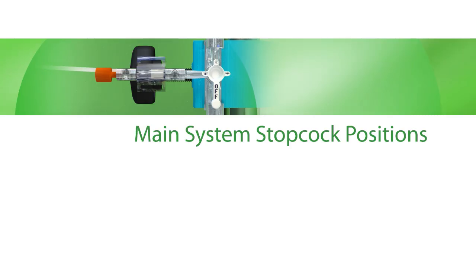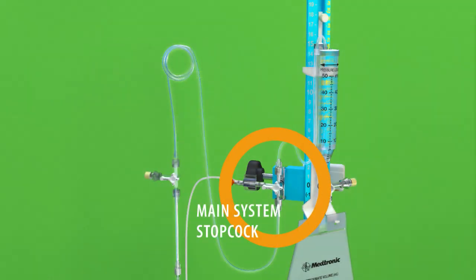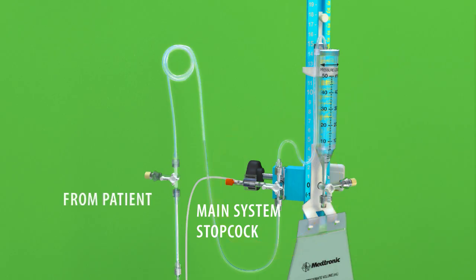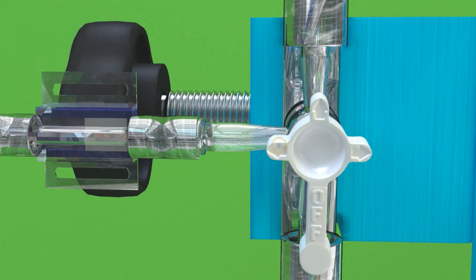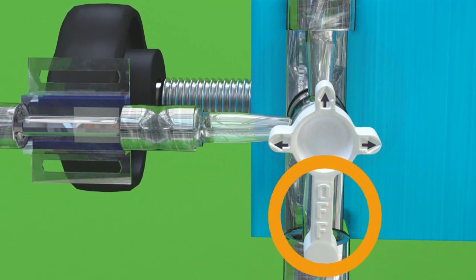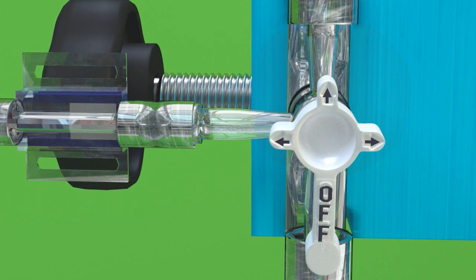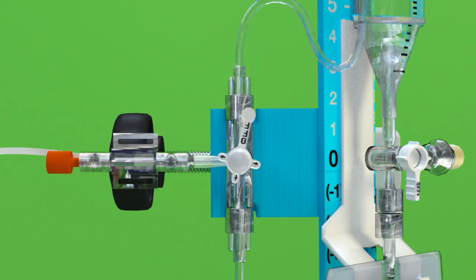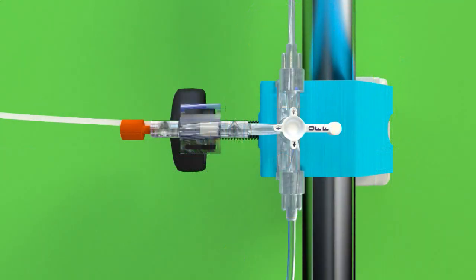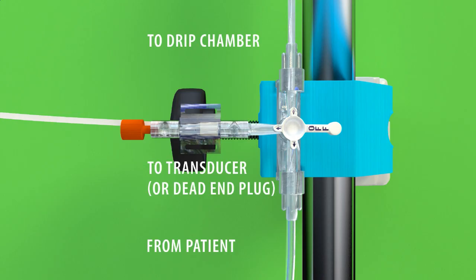Main System Stopcock Positions. The main system stopcock controls flow from the patient line stopcock to the transducer adapter or dead-end cap, and onto the drip chamber. Like the patient line stopcock, the main system stopcock is marked with three arrows, as well as an arm marked with the text OFF. The arrows indicate the directions in which fluid can flow, while the OFF arm indicates where the fluid cannot flow. For example, when the OFF position is rotated away from all of the lines, the fluid from the patient line stopcock is allowed to flow to both the transducer adapter or dead-end cap and to the drip chamber.